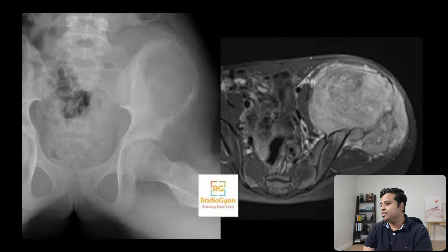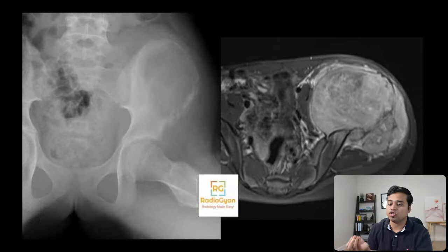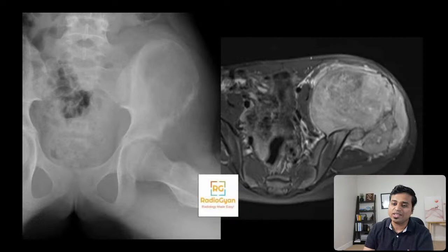Ewing's sarcoma and fibrous dysplasia have been suggested. But fibrous dysplasia will not have this kind of extensive extraosseous soft tissue — fibrous dysplasia would be confined to the bone, so that's definitely not a differential here. Manish Mohamed has rightly pointed out this is an Ewing's sarcoma.